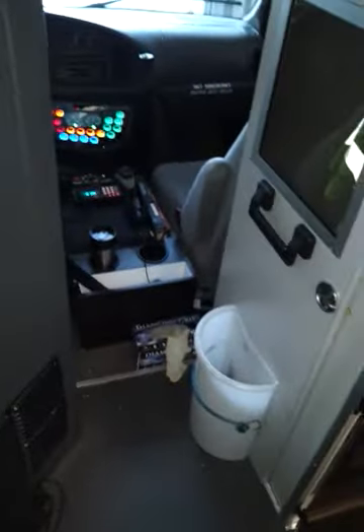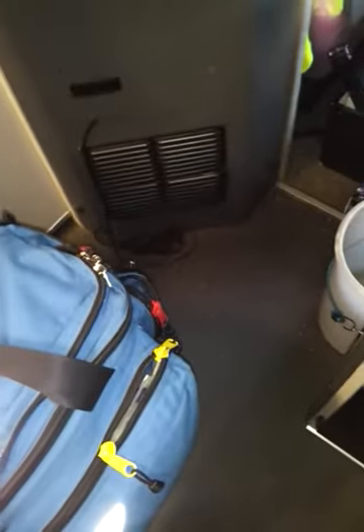This is our jump bag — or some of you may call it a trauma bag — but we call it a jump bag. Same thing. I'll just show you some basic things in it.